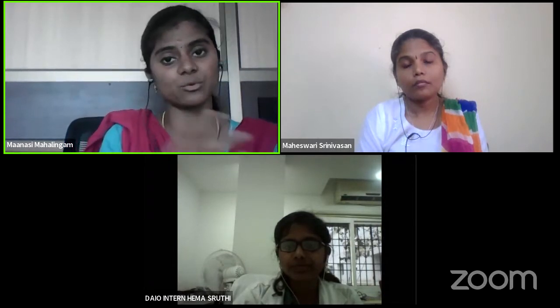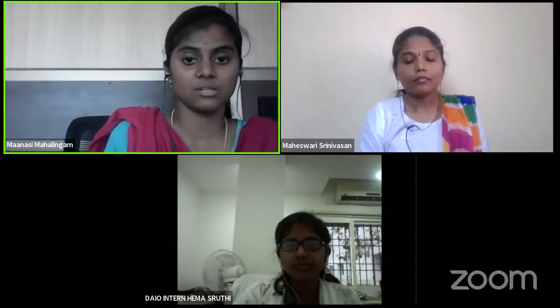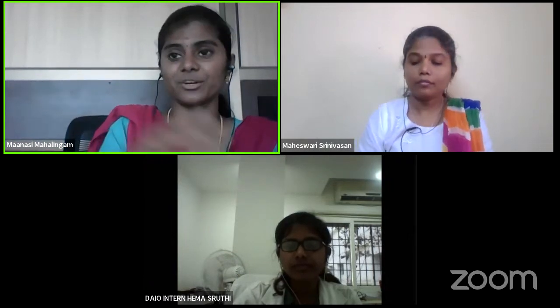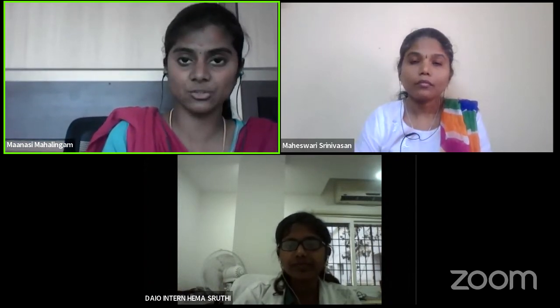Nowadays the whole world is moving towards OCTA. I think OCTA is well studied and well published in all the conditions. But not every finding can be picked up by OCTA. So for some patients, FFA and ICG are still indicated. We are not in a world where FFA and ICG are completely not advised. So for some cases we still advise OCTA, but if the findings are not clear, we will advise FFA and ICGA.